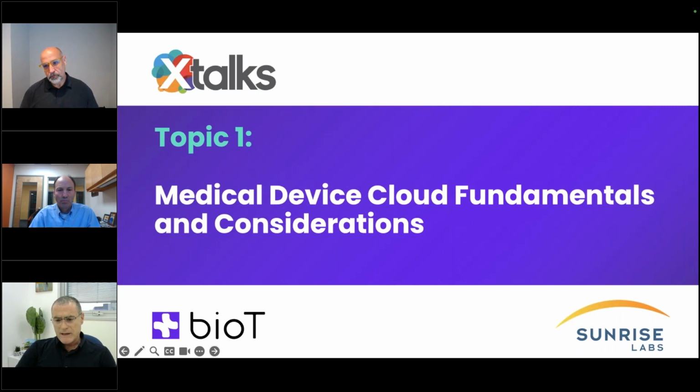The second layer is when the cloud becomes part of the medical device. We call it cloud in a medical device. This is when the cloud is also used to run algorithms or sophisticated workflows and capabilities like alerts and even patient engagement functions, which can be around adherence management, questionnaires, and so on. Which basically translates to better clinical insights and better patient outcomes. And in this case, of course, it's another layer that can be added, and the cloud becomes part of the medical device.